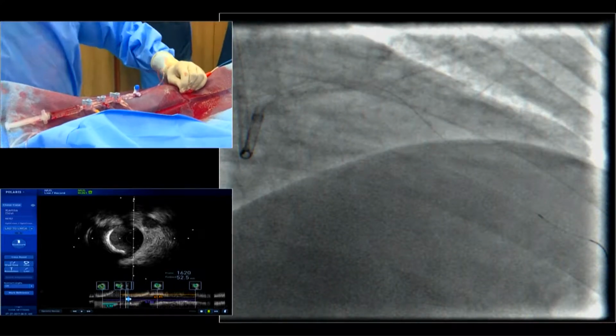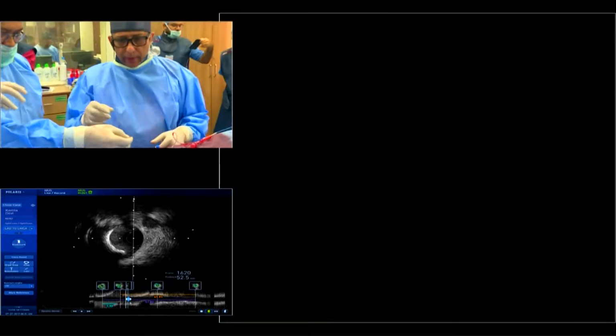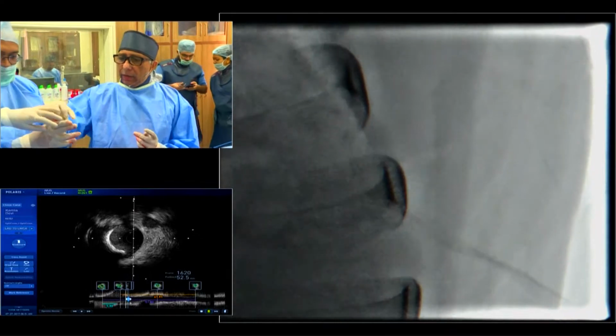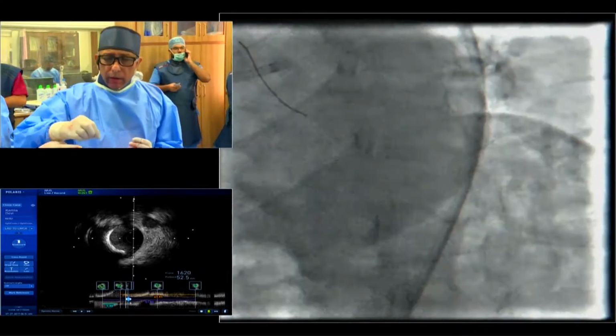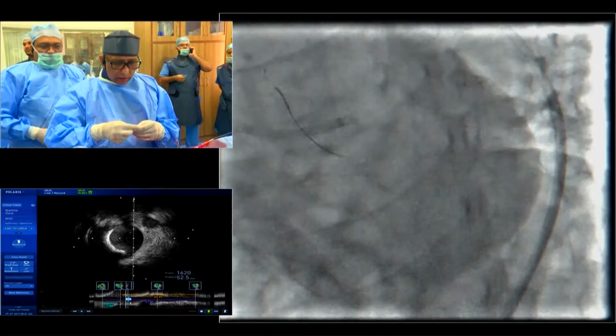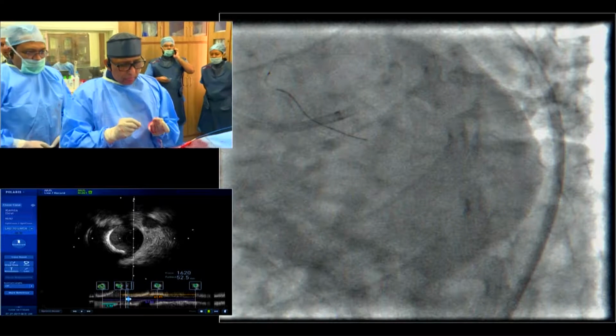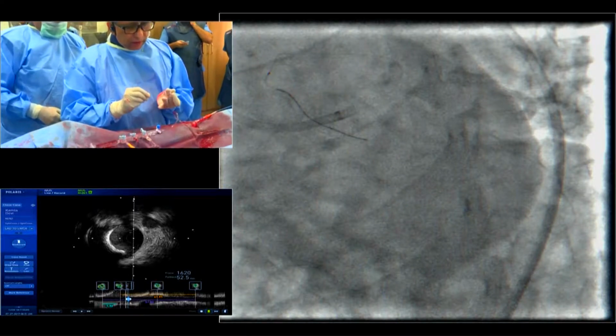Shuvanan Roy, we may switch over to the next lab for another 20 minutes and we will come back again. But we will see for 1 or 2 minutes more. Then we may switch over to the other lab and then come back after 20 minutes. By that time, I think we will have no problem. Excellent result with you. I'll finish probably.